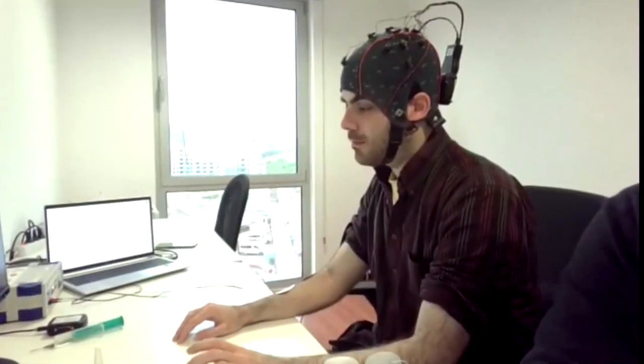So the session already started, and the patient should be concentrated, focused on the therapy. He should be focused on this instruction that he's receiving. So derecha, izquierda, left, and right.